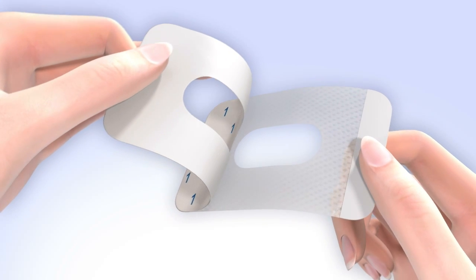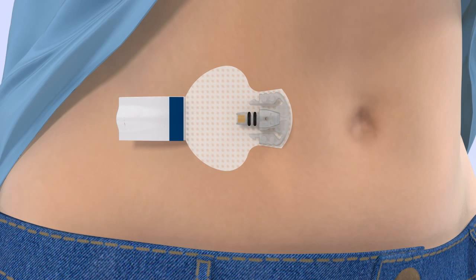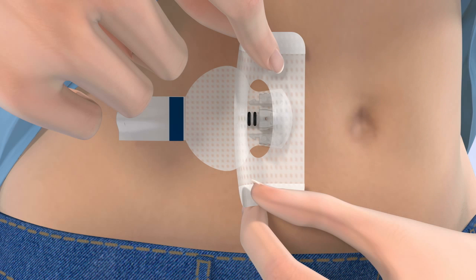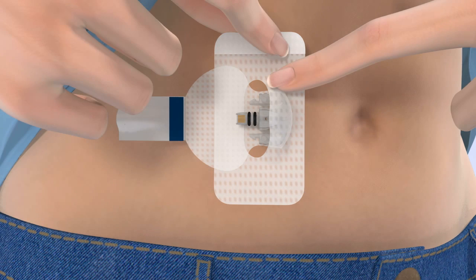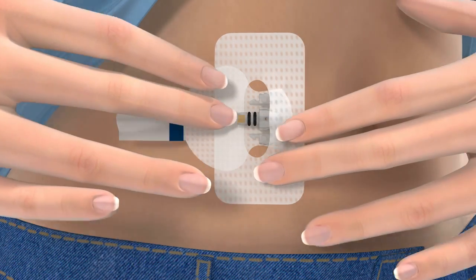The first step is to remove the large paper backing marked with the number 1 from the overtape. Do not remove the two smaller tabs on the sides of the overtape just yet. Hold the overtape by the covered ends and apply one side of the overtape so that it covers both the round part of the sensor and the skin securely. Make sure the tape is covering both the skin and the sensor. Then stretch the remaining part of the overtape around the sensor connector so that it sticks to the adhesive pad but does not block the sensor connector. Smooth down the tape that was placed on the skin, then remove the two paper tabs marked with the number 2 from the sides of the overtape. Press the remaining overtape against the skin.